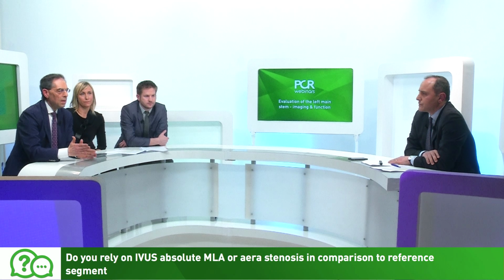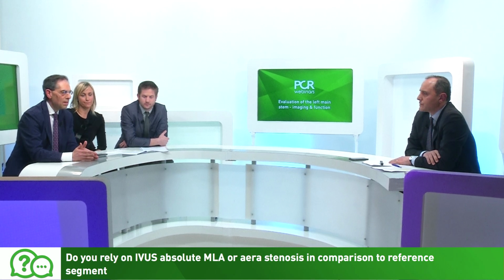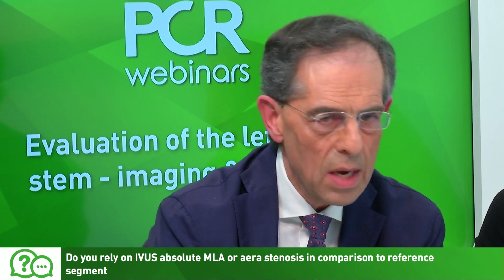So mostly, in left main, people are using IVUS. This is based upon the evidence, and a huge amount of work that was done. The essential from this data is, number one, the minimum lumen cross-sectional area is based on the population. So for Western people, the most approved in terms of sensitivity and negative predictive value is 6 millimeters square.